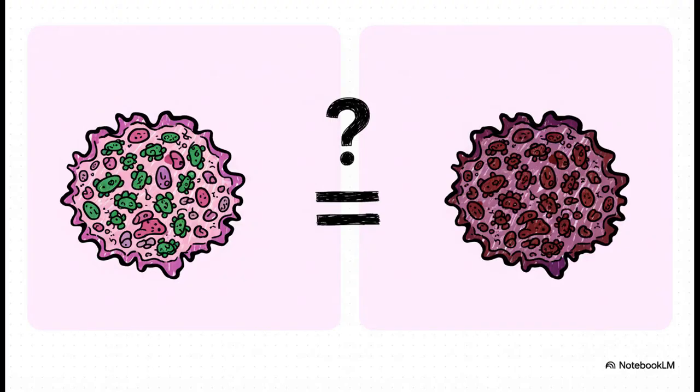So our first imposter is an atypical infection. It sounds weird, but a really severe inflammatory response in the breast tissue can create a mass that looks dense and irregular.